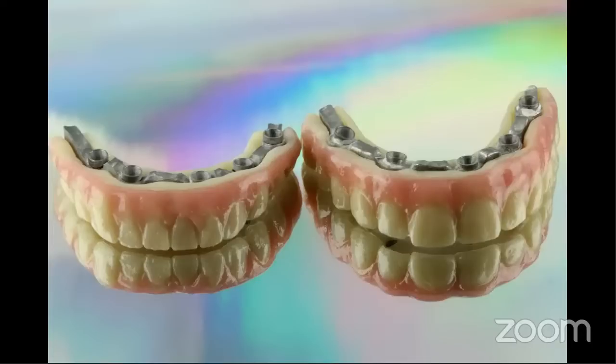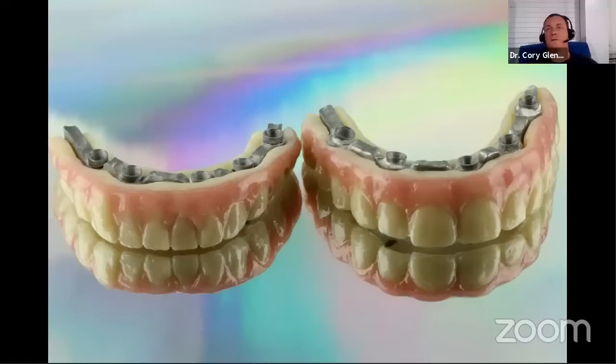Okay. How do you preview the index position of the implant when planning a tie-based crown before surgery? Well, remember, you've got your virtual implant. When you position a tie base on it, that shows you exactly where the tie base margin is. So that might tell you that you're placing it way too deep or way too shallow, but it's purely a matter of just right-clicking the implant.